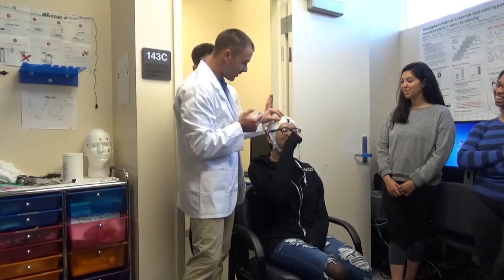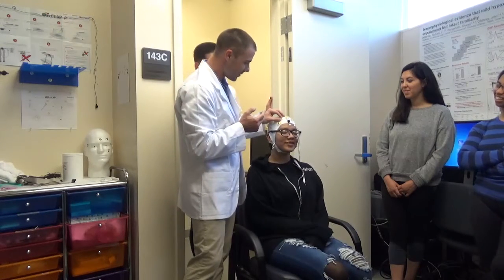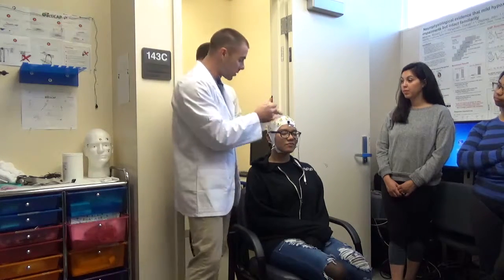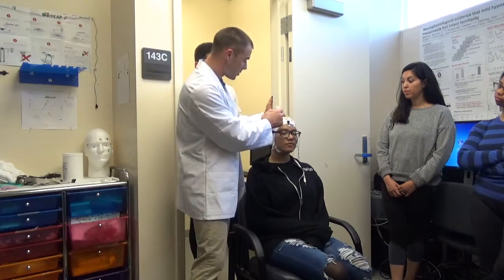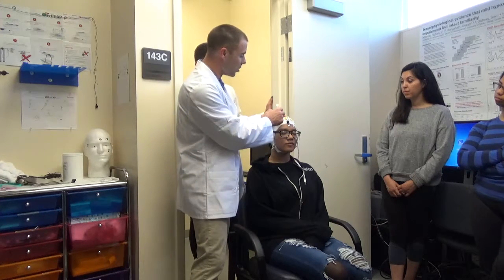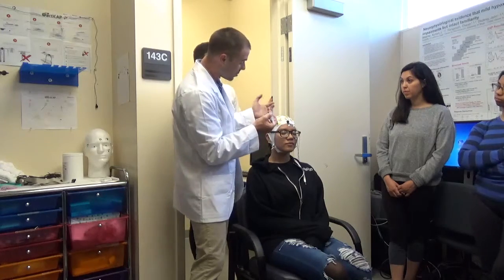Yeah, you feel that, right? Can you feel that? Did it hurt? No, it was too good. Yeah, that means you're doing it about the right tension. You don't want it to hurt, and especially when you start, you say, okay, so what I'm going to do now is I'm going to take the blunt end of the syringe, and I'm just going to kind of move it around a little bit. You should feel it on your scalp, but it shouldn't hurt.